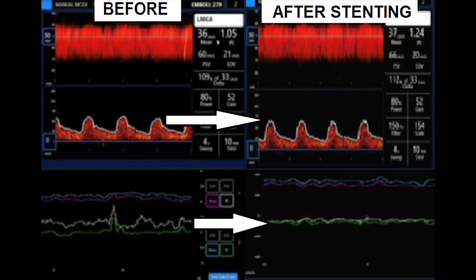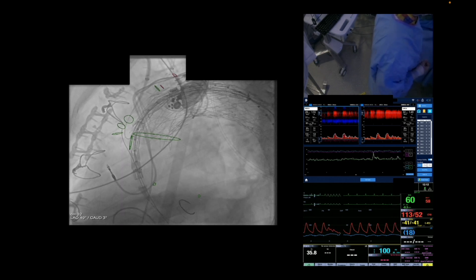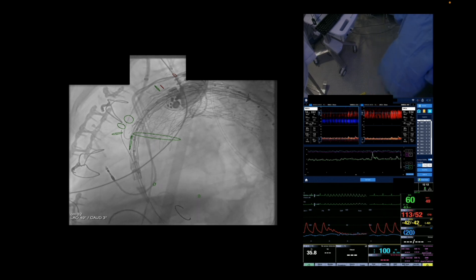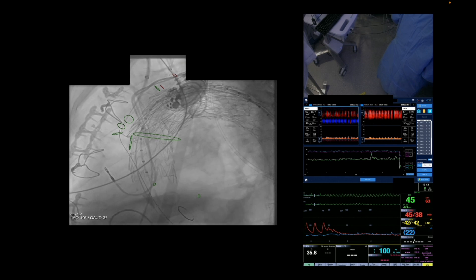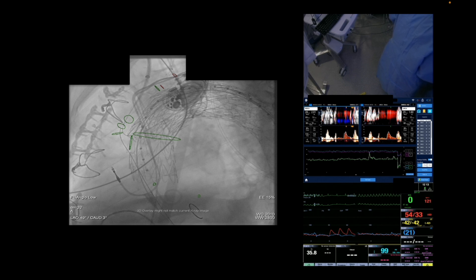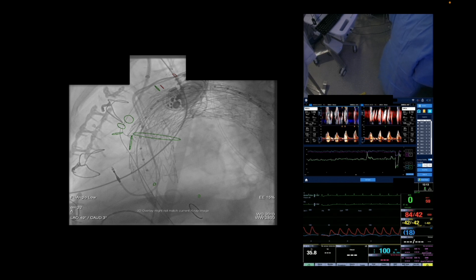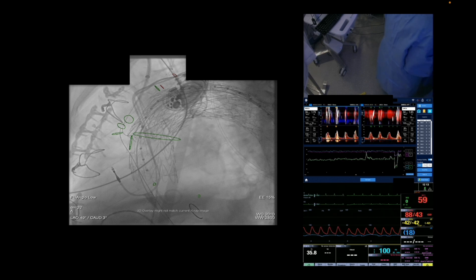Our pulsatility index trend plots are now matching on both sides, whereas formerly we saw lower PI numbers on the left. Low PI numbers in this case were a sign of autoregulation compensating for proximal stenosis, which should now be resolved. During the deployment of the Gore endograft, we can appreciate on TCD how rapid pacing temporarily causes very low flow volumes in the MCAs on both sides. The low cardiac output during deployment is necessary so the graft is not displaced by the large volume of blood exiting the heart. There are many hits on TCD during deployment, but afterwards flow returns to normal bilaterally.